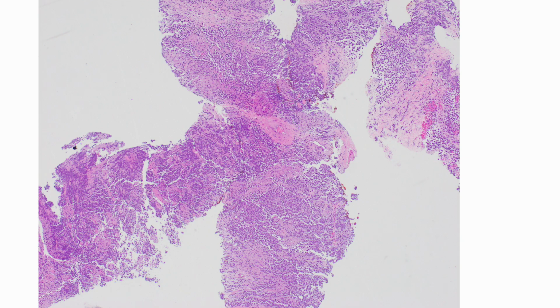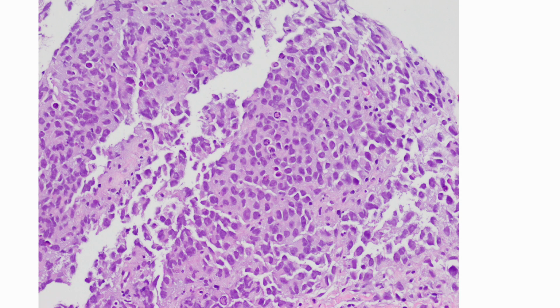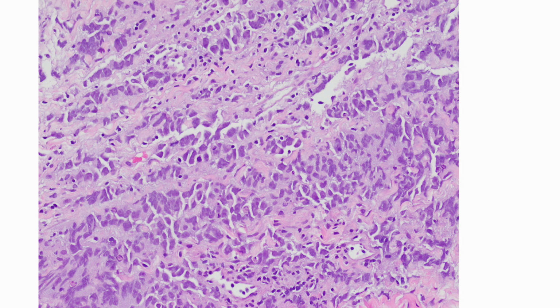On the core biopsy, the normal lymph node architecture was completely effaced. We observed irregular sheets and small nests of abnormal cells with abundant fibrosis. At higher magnification, the tumor cells appeared monotonous, with prominent nucleoli and a moderate amount of pink cytoplasm. There were numerous mitotic figures and apoptotic bodies, indicating a high-grade malignant neoplasm. In other areas, tumor cells formed linear and small clusters separated by fibrosis, with small lymphocytes intermixed.